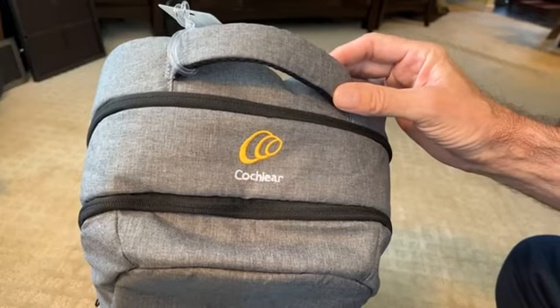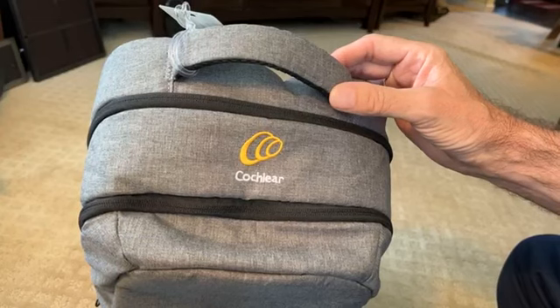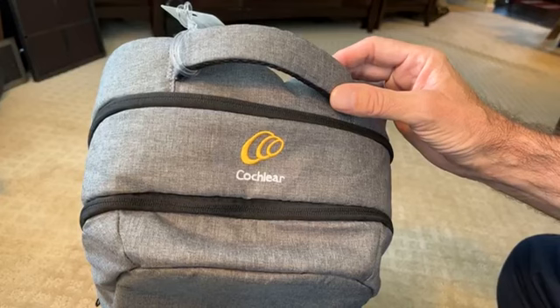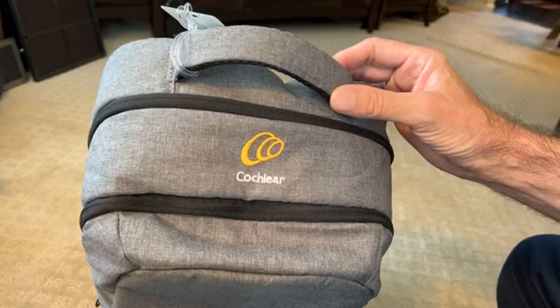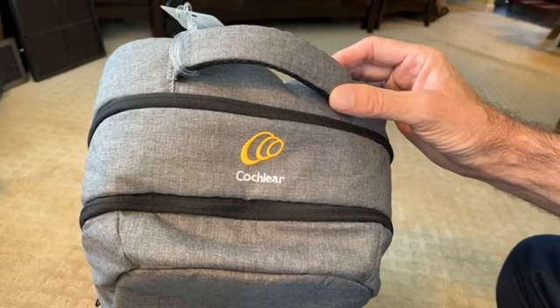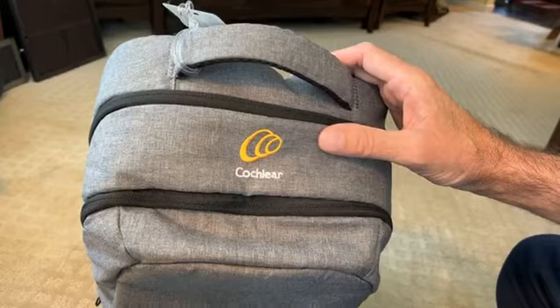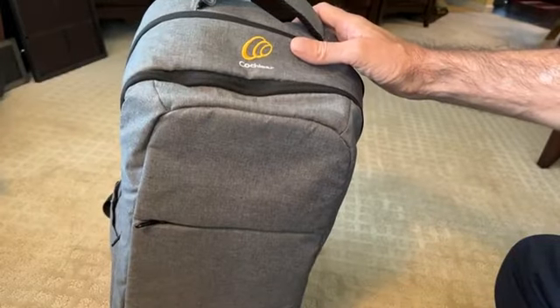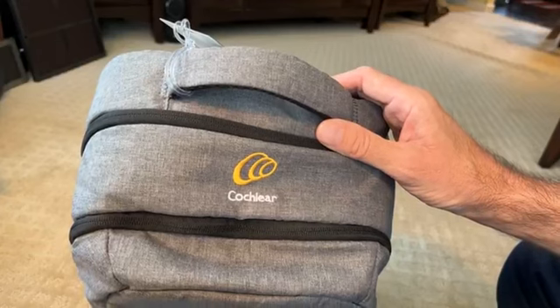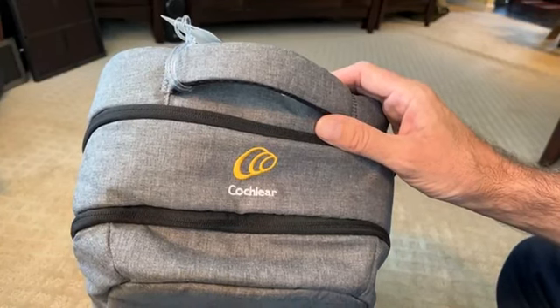Let's take a look at what all I got. I had my cochlear implant insertion and activation this month at Vanderbilt in Nashville, Tennessee. And I was surprised when I went to get it activated that she showed me I got a bag of accessories. I thought, in case you're getting one and you're not aware of what all comes with it besides just the obvious implant, I'll show you.